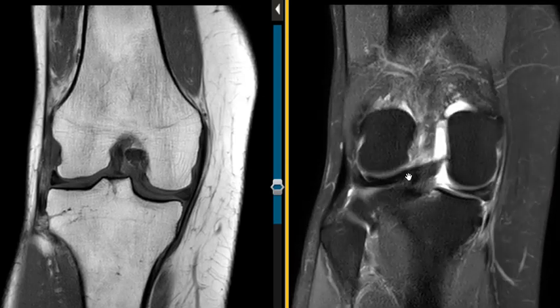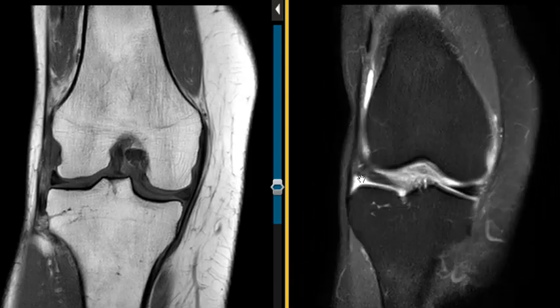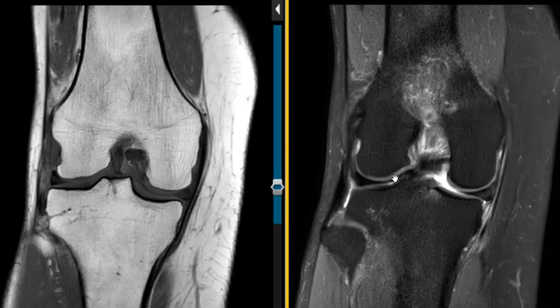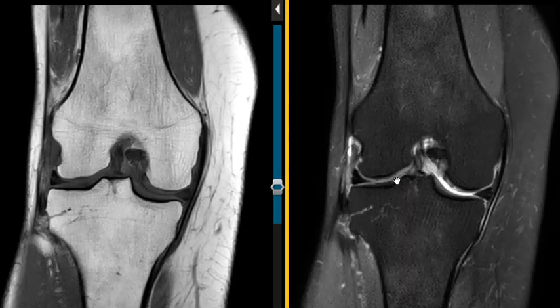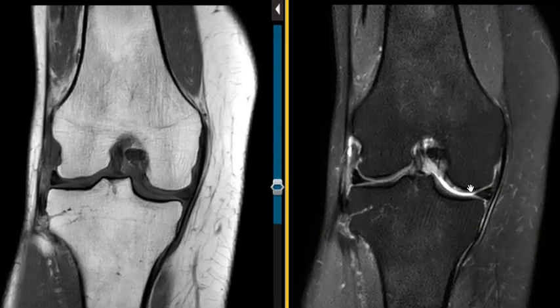To review normal anatomy, this is the lateral meniscus. Here's the posterior horn, coming over, here's the meniscus body, anterior horn — it's like a C-shaped ring. This is held tightly in the front and back, and we see the meniscus — this black triangle — fitting tightly between the condyle, the femur, and the tibial plateau. This is a normal appearance of the lateral meniscus.